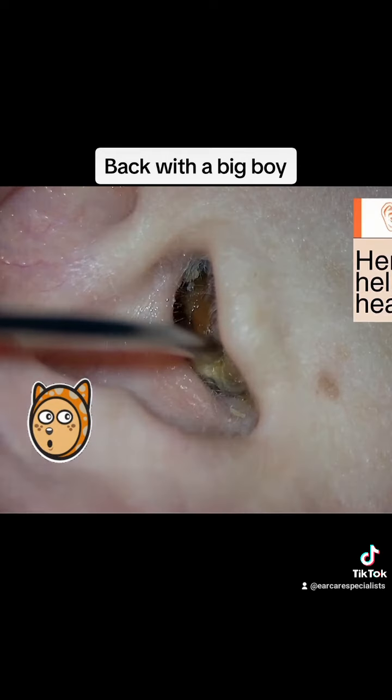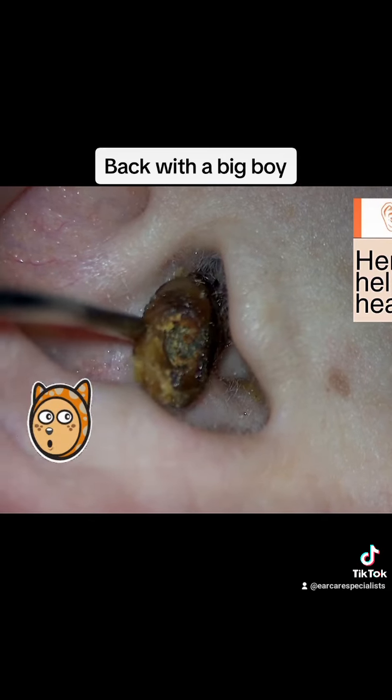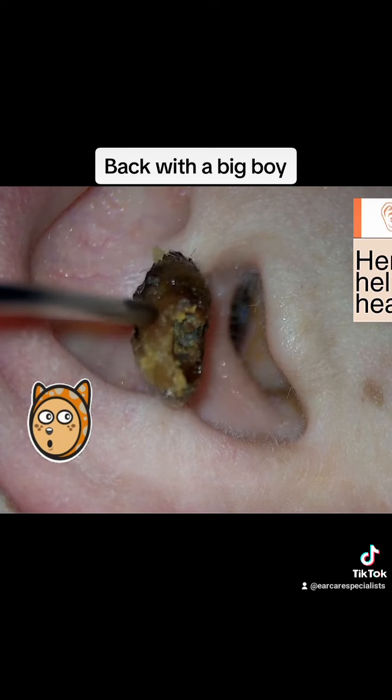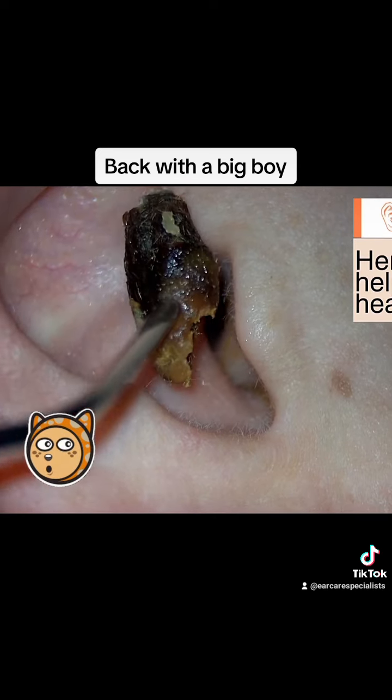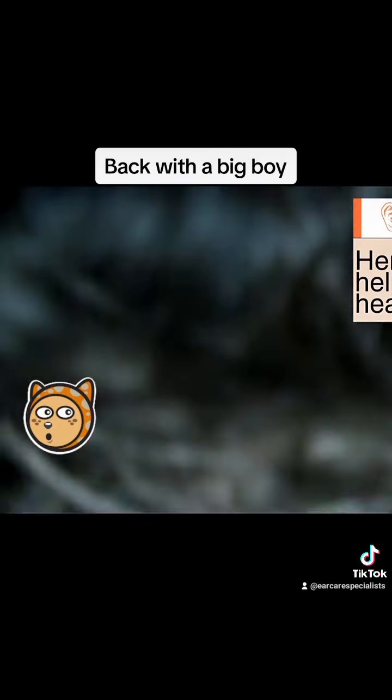A bit of skin on the side of it there as well. That's why it's a different colour. And here we go, huge relief. Patient will feel much better once that comes out, and their hearing would be much improved. We'll go back in and take a look to make sure the coast is clear.